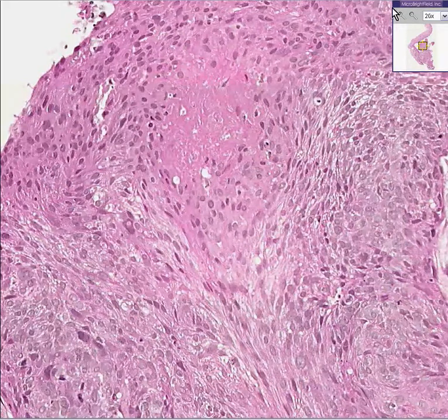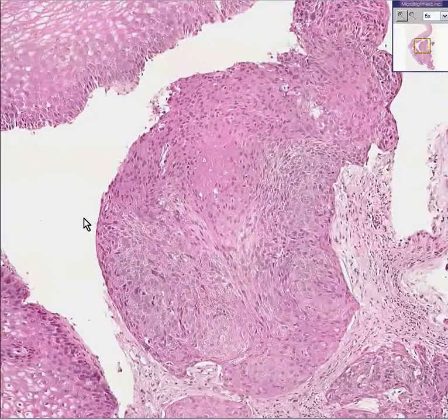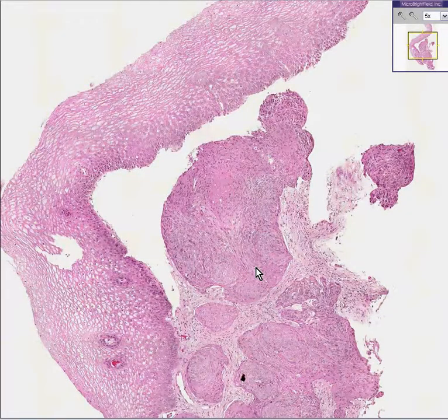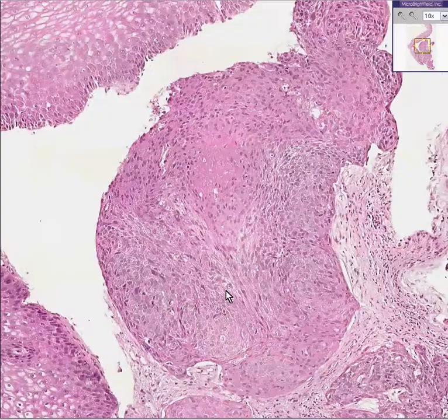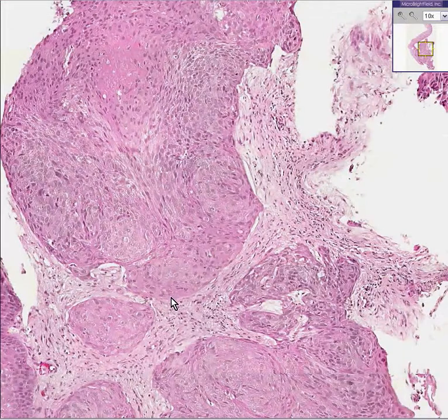And that makes a big difference in the cervix, because squamous metaplasia replaces the spaces of the endocervical glands by normal-looking squamous cells. But infiltrating squamous cell carcinoma doesn't replace anything. It invades not only glands, but directly into the tissue as well.